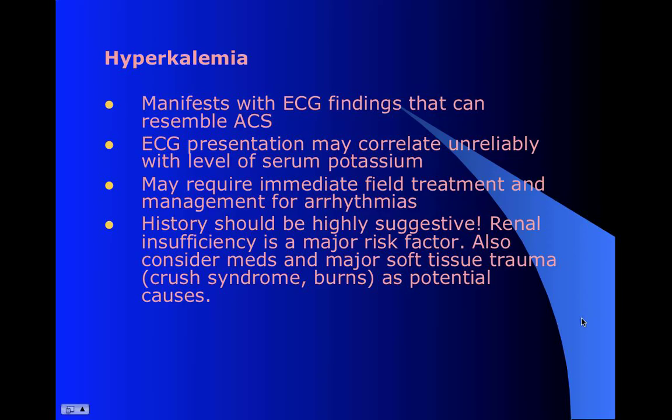Hyperkalemia. Now, hyperkalemia is tough. It's been called the great mimic, or the syphilis on the EKG. It can look like a heart attack, and it can also kill people. So you want to be able to catch these, and it's actually very amenable to treatment in the field. It's maybe the only abnormality of electrolytes which you can and should be managing out there, because it can acutely kill people, but you can really readily address it.